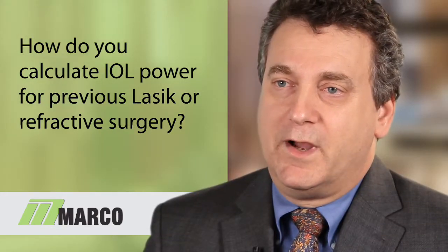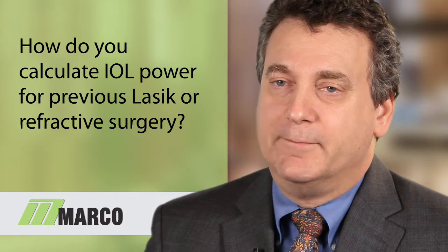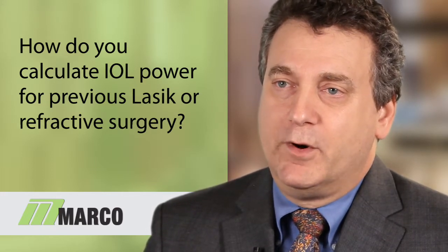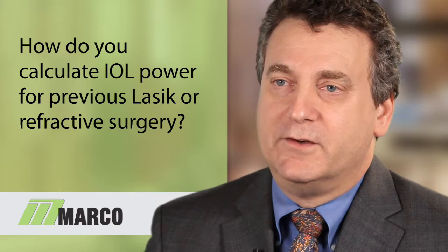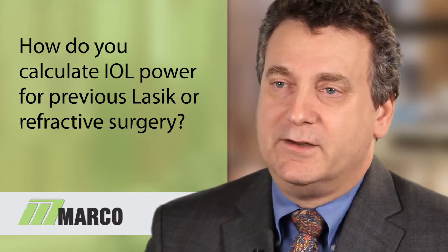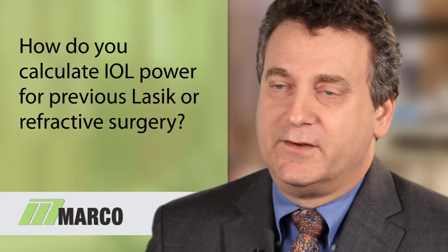But the other reason why I like to have the OPD scan in addition to just the average pupillary power, or APP, is I think it's really important to look at the corneal topography in these patients. I'm always impressed at the number of people who've had prior laser vision correction that do have a permanent corneal cylinder etched into their cornea, presumably to treat a compensatory lenticular astigmatism.